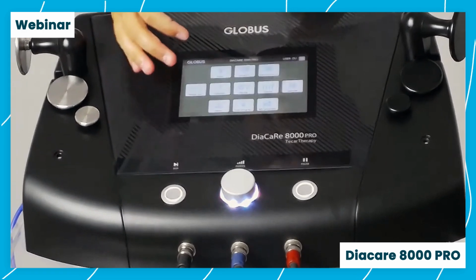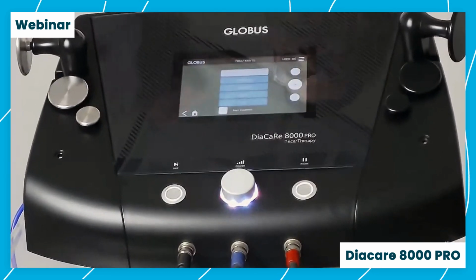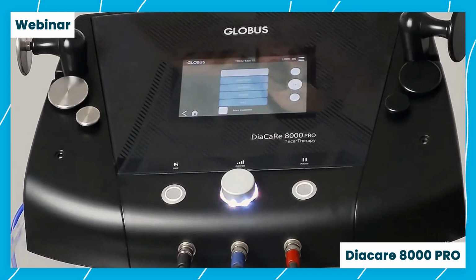If we go back here, we can also go sport specific. There's loads of different sports in here. All of them have different kinds of injuries that are common in those, and it'll give you the exact protocol for that injury.